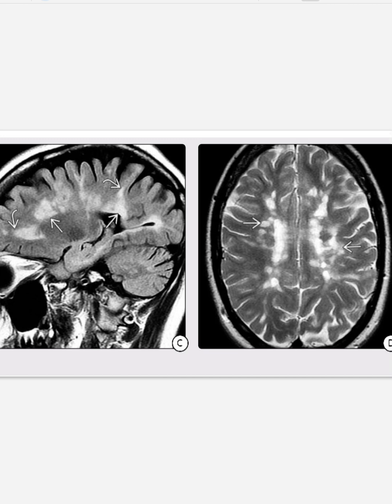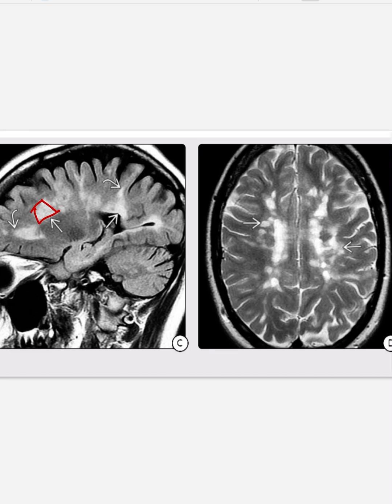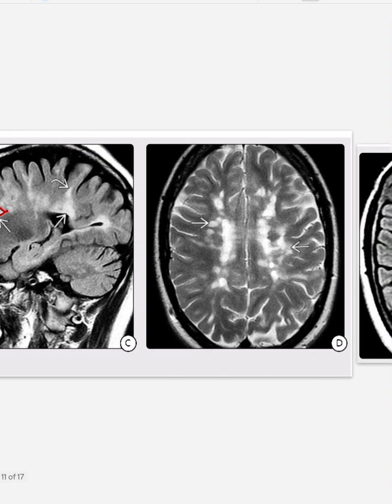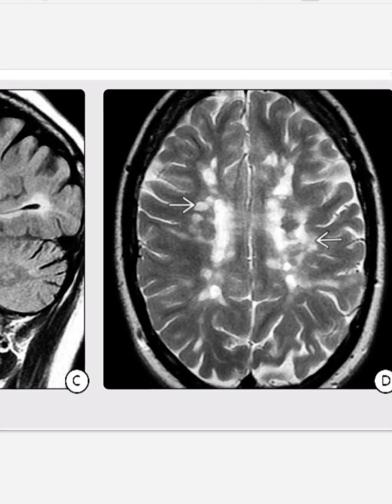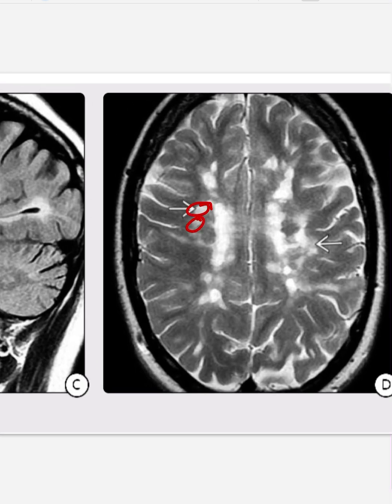The next case shows FLAIR with characteristic triangular configuration of typical deep white matter plaques in the sagittal plane. The broad base of the triangle is oriented toward the ventricular surface with the apex pointing toward the cortex. On T2, ovoid periventricular plaques are also seen oriented perpendicular to the lateral ventricles.